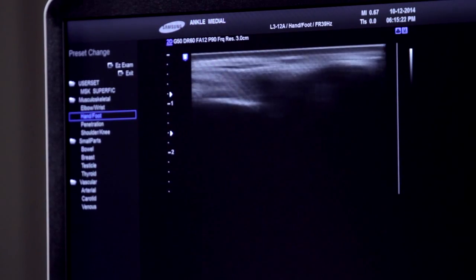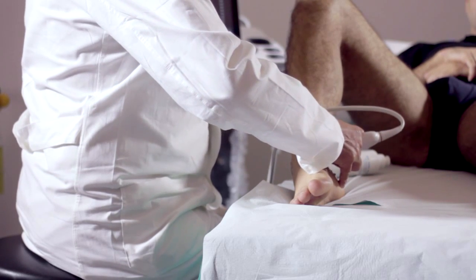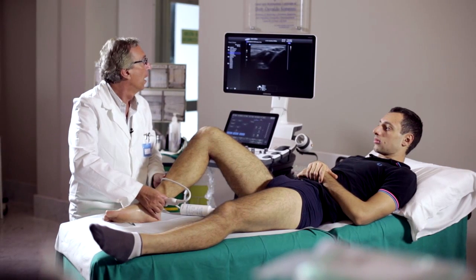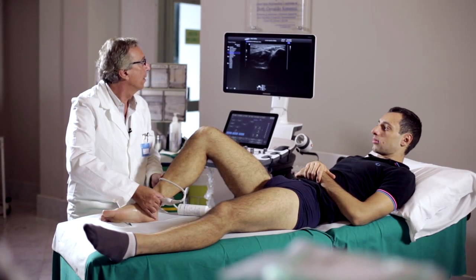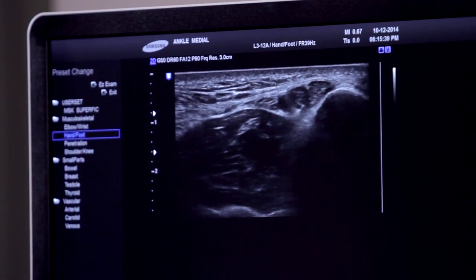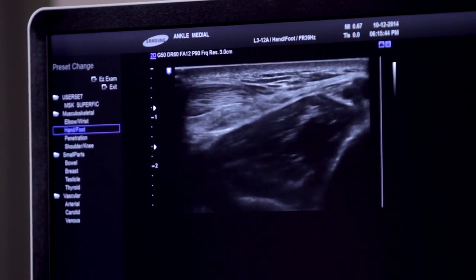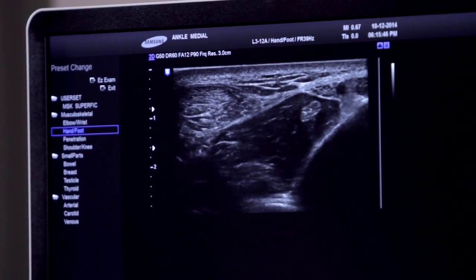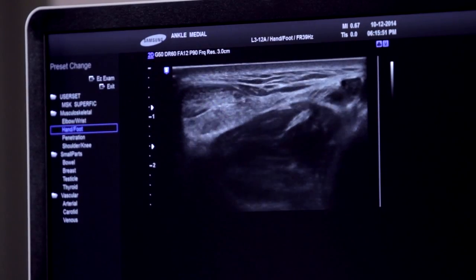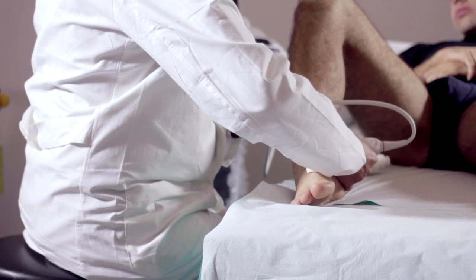We now go back and we display two more posterior structures, which are represented by the flexor digitorum tendon and, finally, contiguously to the flexor digitorum, the vascular nervous bundle with a characteristic aspect of the tibial nerve. We can also evaluate the extension of another tendon, which is the flexor hallucis longus. All these structures can be displayed on both axial planes, so on the short axis and on the long axis.